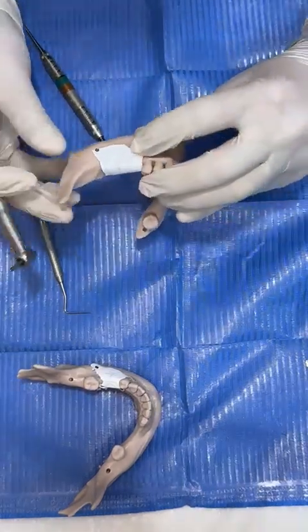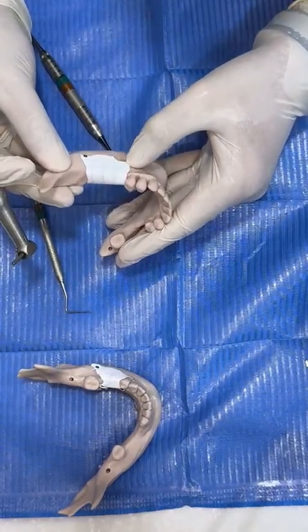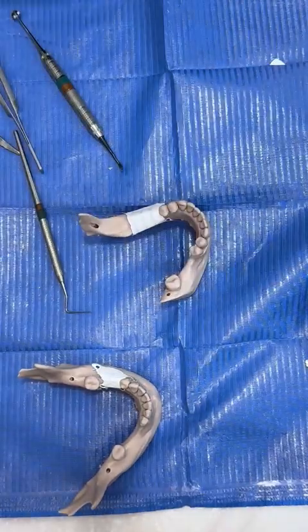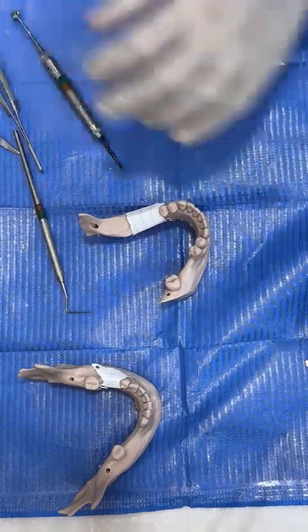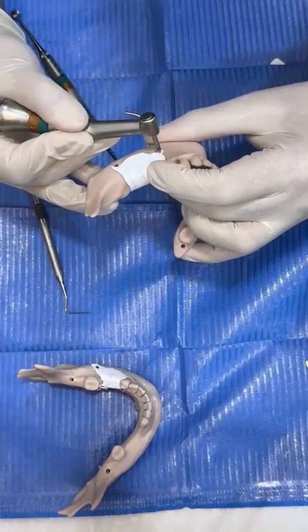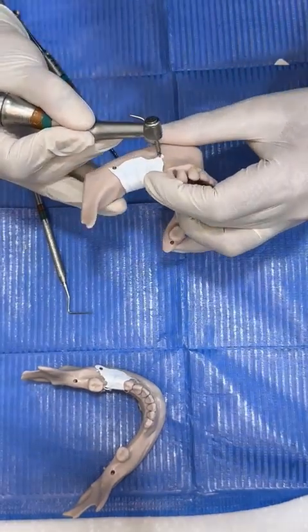Okay, and now the last screw on the mesio-buccal, this one. After this, I can finish this with the remaining with tacks. Even this last one can be done with tacks.